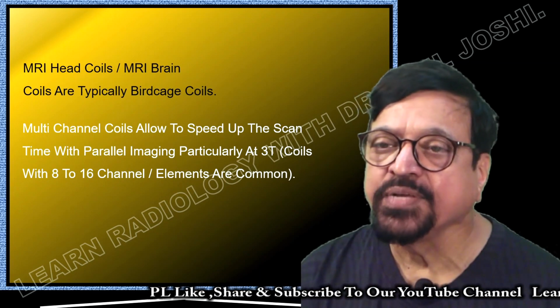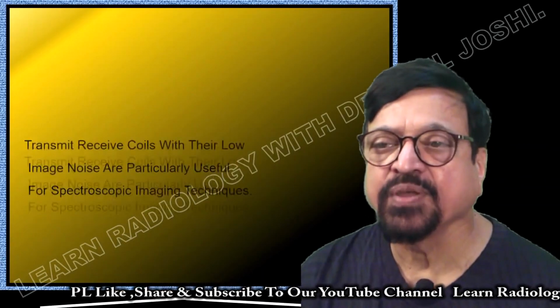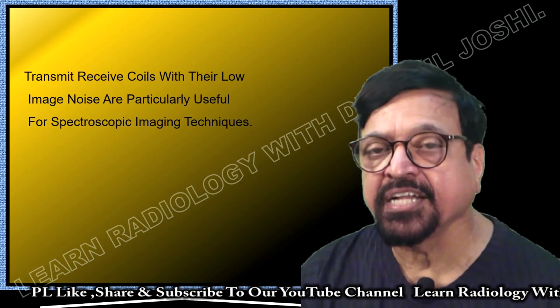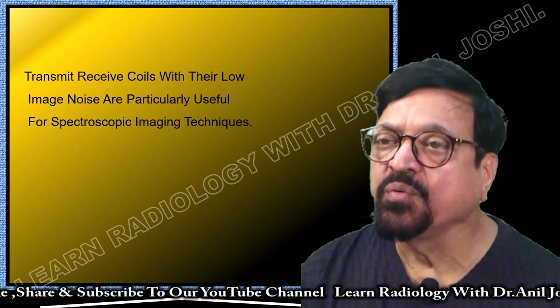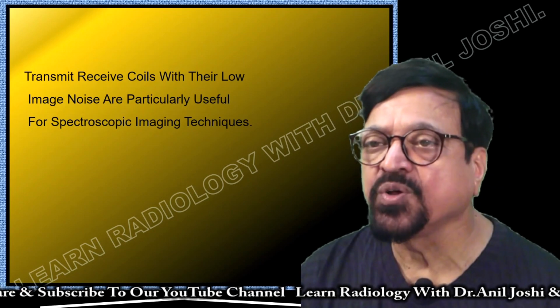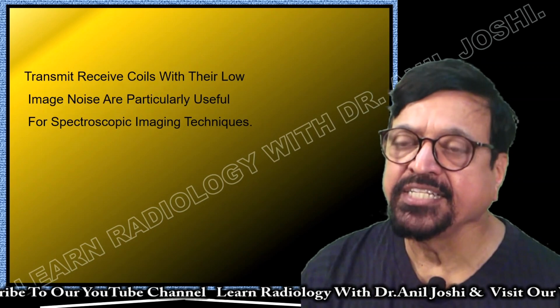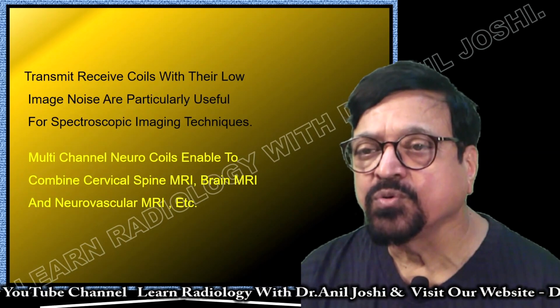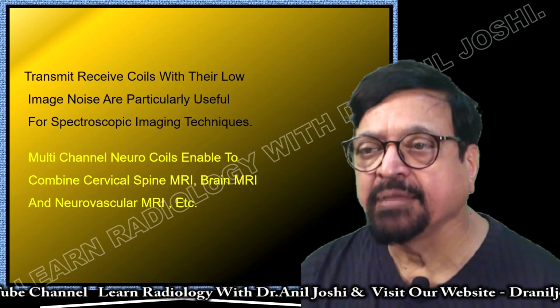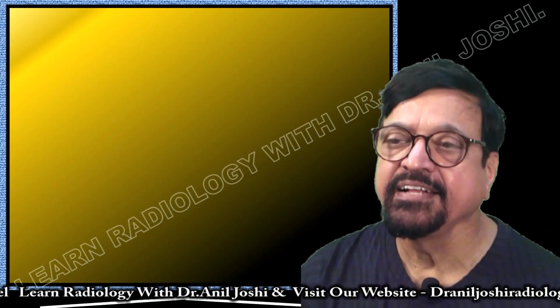Coils with 8 to 16 channel elements are commonly used in 3T, and that is why 3T gives you better imaging. Transmit receive coils with their low image noise are particularly useful for spectroscopic imaging techniques. Multi-channel neurocoils enable combining cervical spine, MRI brain, and neurovascular MRIs etc.